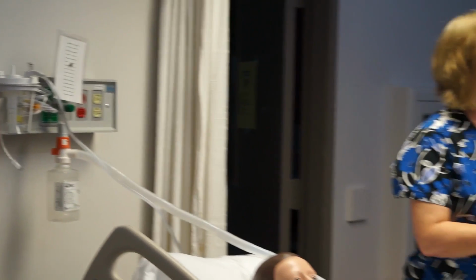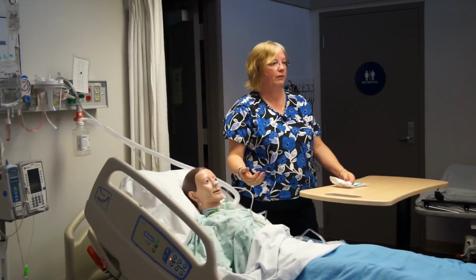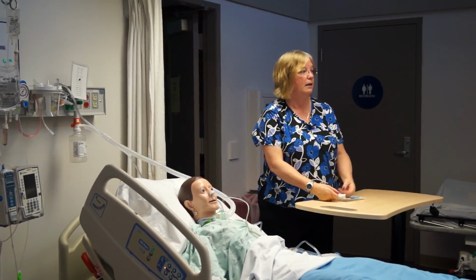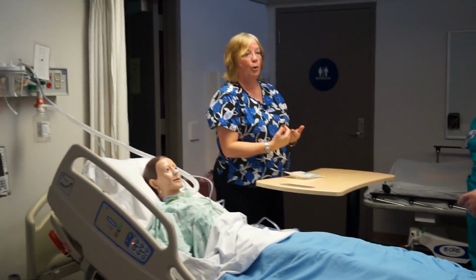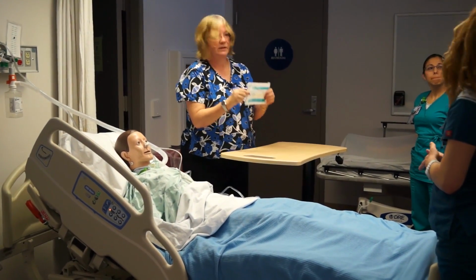The other way we thin our secretions out is by giving our patient tube feeding or free water, so we always want to keep track of intake and output. The thicker the secretions are, potentially they're developing some kind of infection, or the patient isn't hydrated enough. Okay, so we're going to have a suction cath kit.